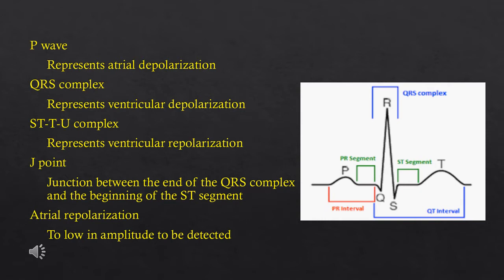The atrial repolarization, which is low in amplitude, is usually not detected and is obscured by the QRS complex.